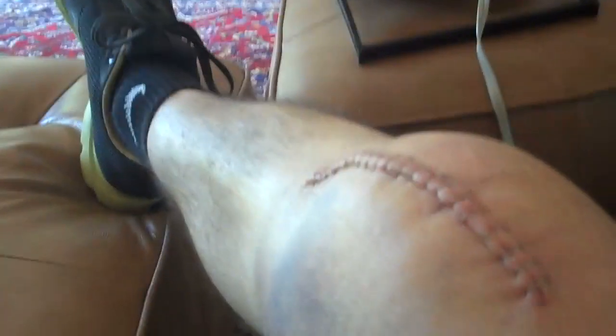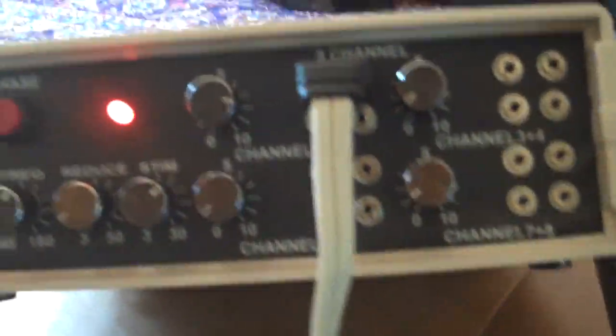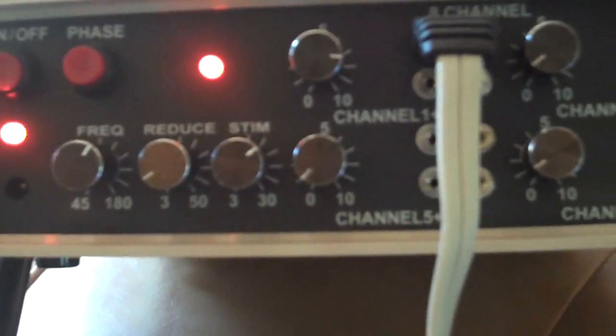This is five days after surgery. I'm icing it a lot and using the stimulator, the 16 TP. I've got it on about level eight because there's so much swelling I can take a lot, and I've got the frequency up over 100 — about 120 right there. You just can't get a better tool to help with your rehab than a muscle stimulator like this.